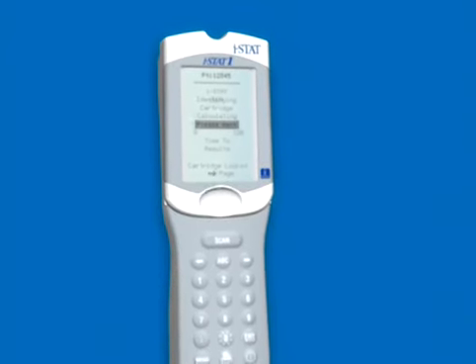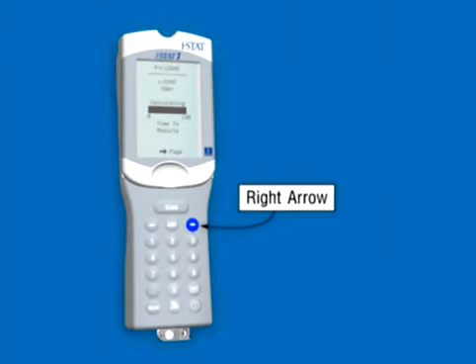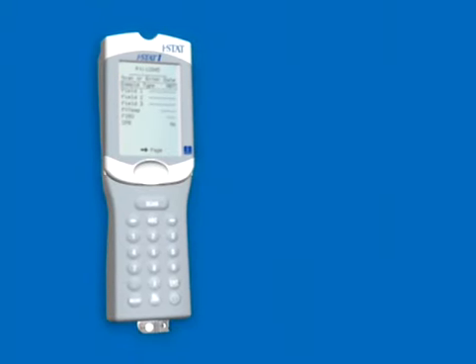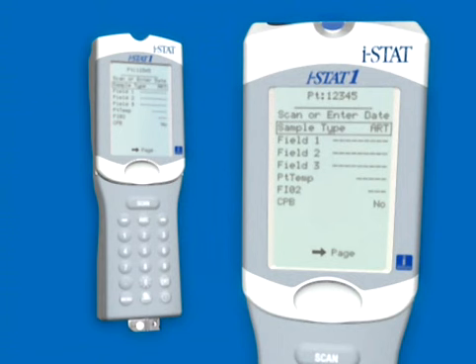As soon as the word Page appears at the bottom of the screen, press the right arrow key to access the chart page. The operator can enter the following information on the chart page. If prompted, enter the patient temperature. Entering this value will provide temperature-adjusted blood gas results. Now press Enter.